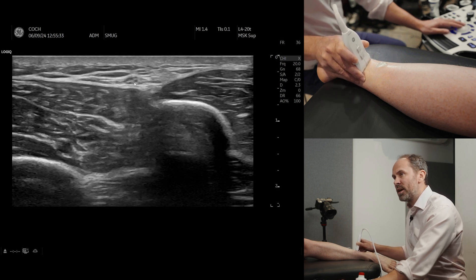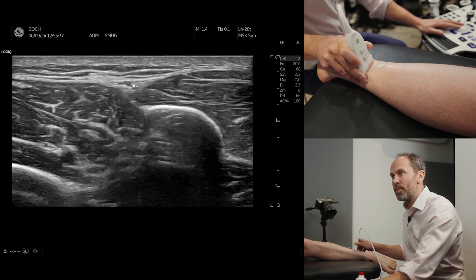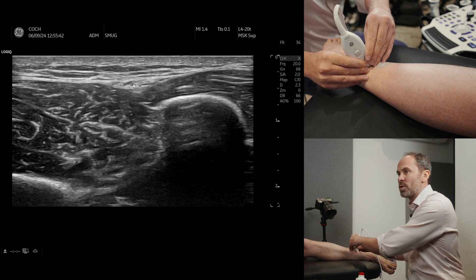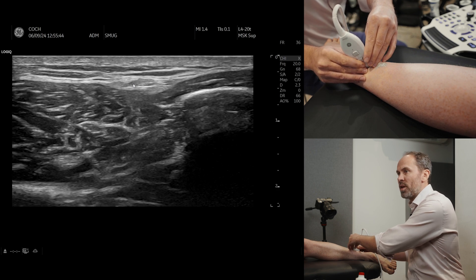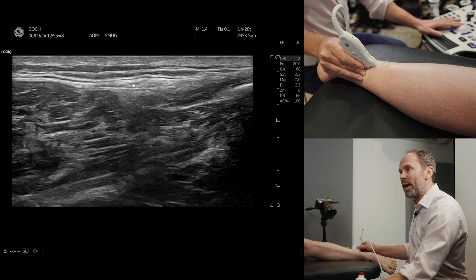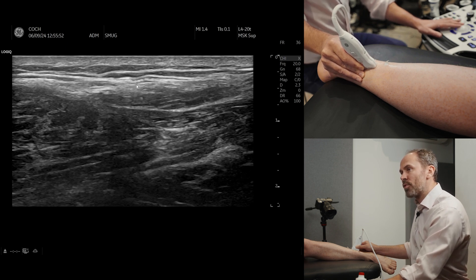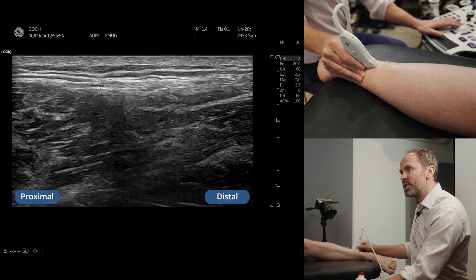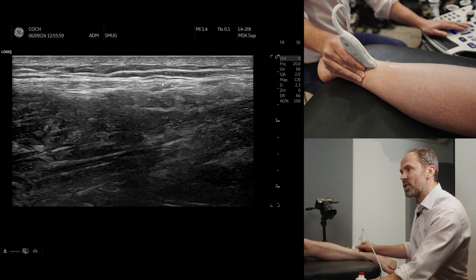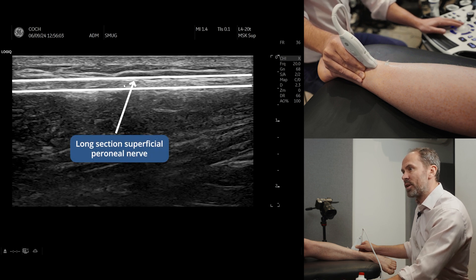Now the entrapment point — what you'll see is you'll see the nerve get bigger at the entrapment point. If you're good at scanning, you can keep that in the middle, use two hands so you don't slip off, and then you'll be able to see that nerve going all the way from left to right. You can see the proximal end where it is deeper to the fascia, and then you can see it going superficial to the fascia. You can see it in long section very nicely.